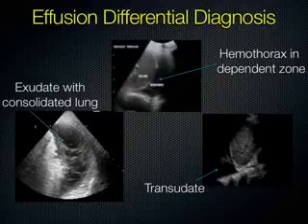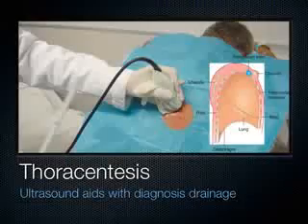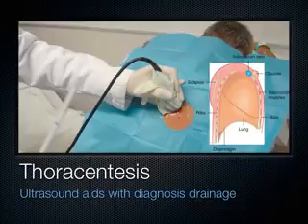We also use the probe in real time with a sterile glove or a sterile cover on it to guide procedures. Many times people will just mark it with an X and then reposition the patient in about the same position and hope for the best. But I think if you've got the ultrasound available to you, it's best to use it in real time, because look at all the vital organs that are pretty close to where you're going to be putting a pretty large bore needle.